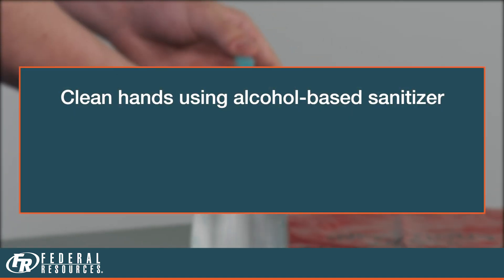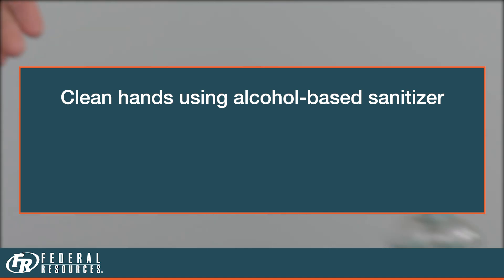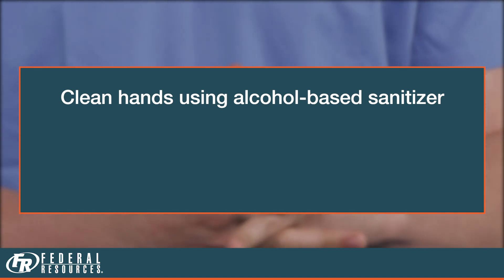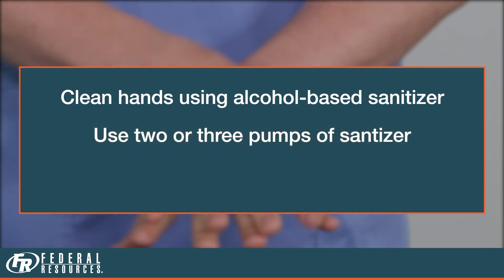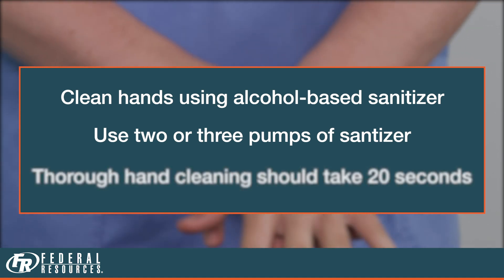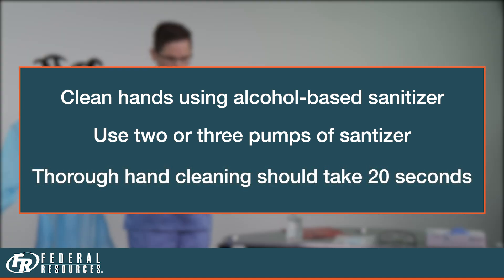First, clean your hands using an alcohol-based hand sanitizer. Good hand hygiene is the cornerstone to safely donning and doffing PPE. Use two or three pumps of alcohol-based hand sanitizer. Thorough hand cleaning should take about 20 seconds.